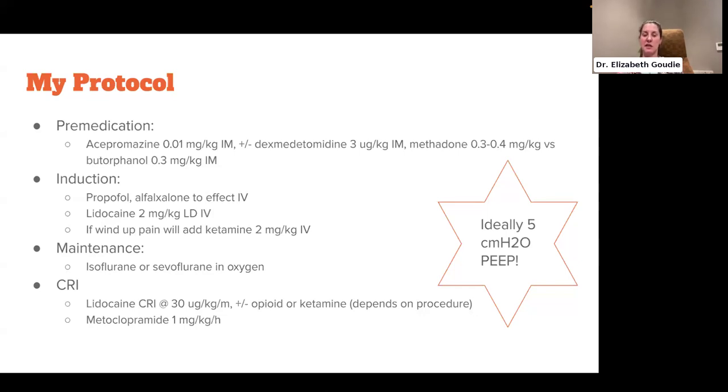But again, I'm often giving these guys a 5-10 ml per kg fluid bolus at the start before I move into MRI, because I find a lot of times they are fluid deplete from panting, not drinking, etc. If they can be on fluids before I have to anesthetize them for an MRI, that makes me very happy, but I know that often does not get to happen. They come in, they run through the ER, they get seen, and they have to get into the MRI immediately so that they can get surgery the same day. Maintenance with iso or sevoflurane and oxygen.